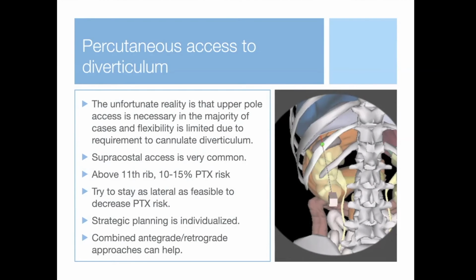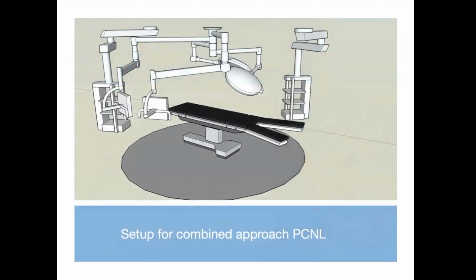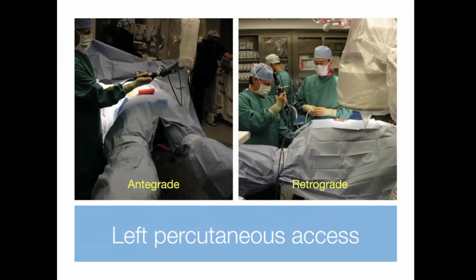And strategic planning is really individualized. We generally do a combined above and below approach to percutaneous surgery on a split leg table. We have the ability to go retrograde and antegrade at the same time.